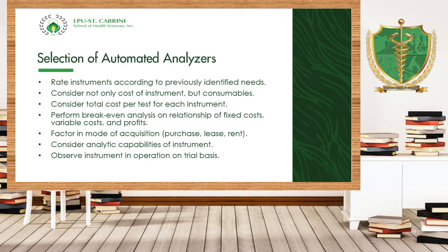So, consider the analytical capabilities of the instrument. Alam ka namang 10 beses ka na na-control in a day, pero until now, hindi mo pa rin na papasok yung control. No? And observe instrument in operation and for trial basis. Siyempre, bago mo yan bitihin, papatayin sa'yo for a month, for a day, for a week. And you have to make an observation.